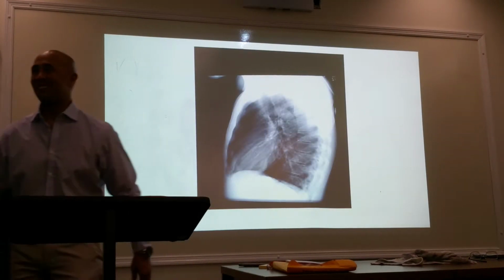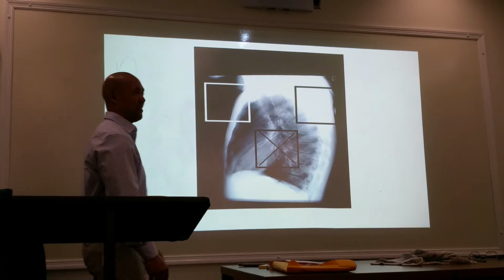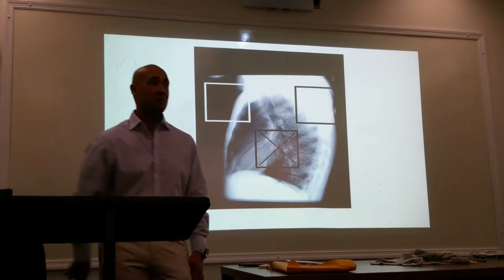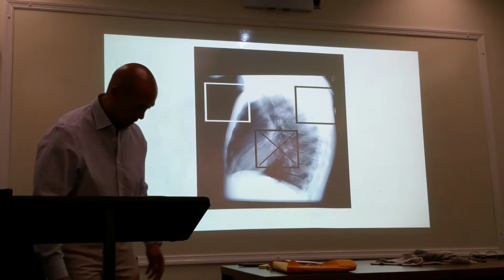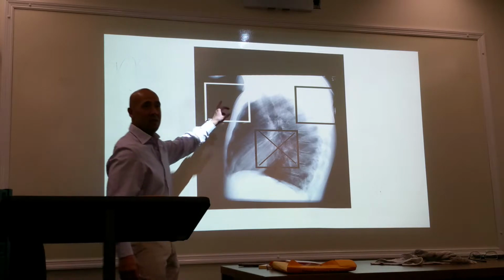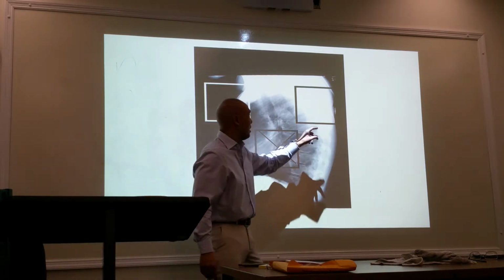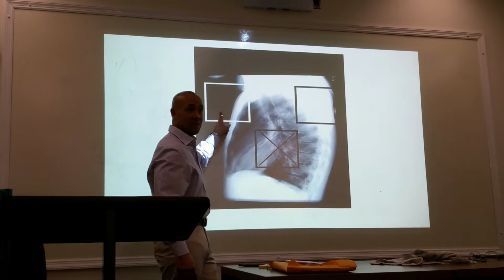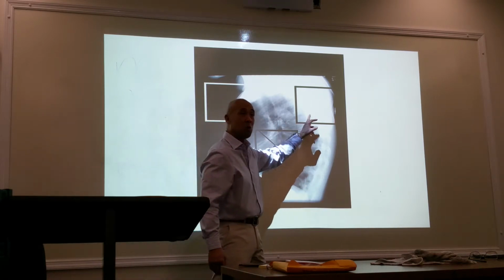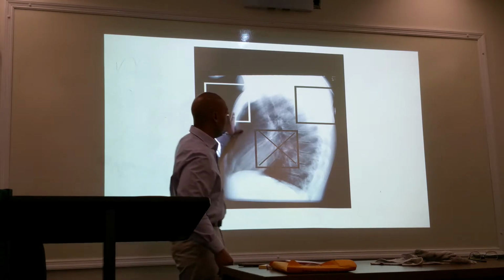Lateral. We've got the 3 cells. Based on your laboratory experiment, which cell are you going to use? Do we want this one? No, you're not shooting anything. Do we want this one? No, this might give you the same effect, because you're not going to have a total body part in that cell. So I'm not going to use this or this.